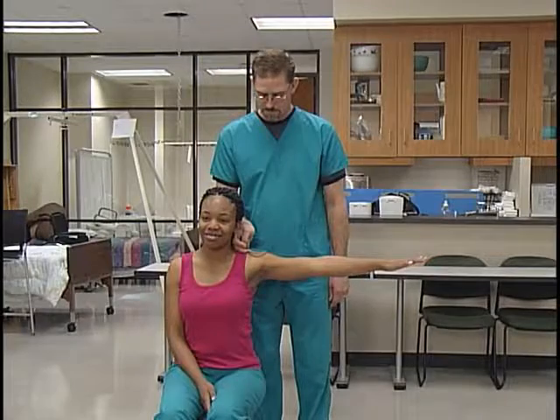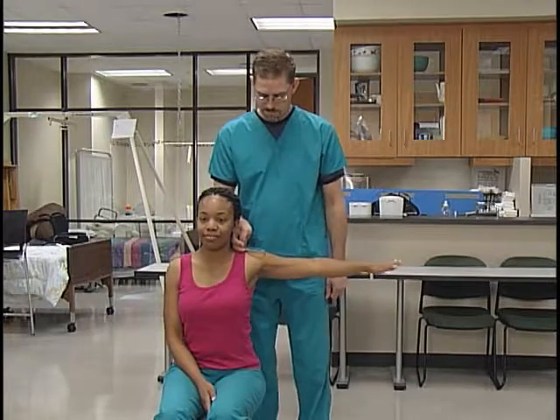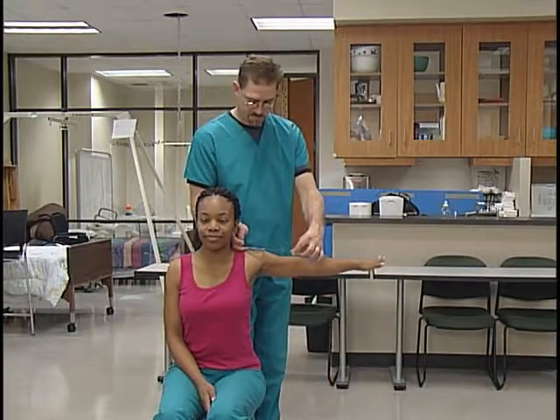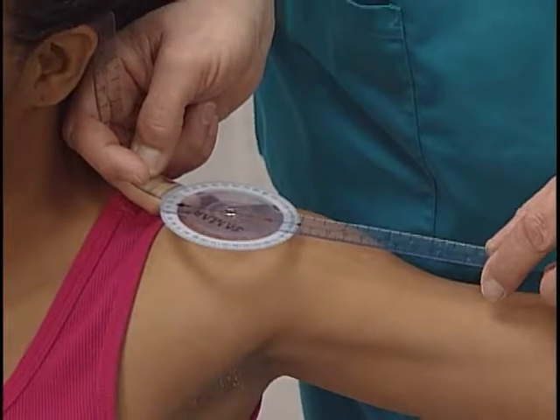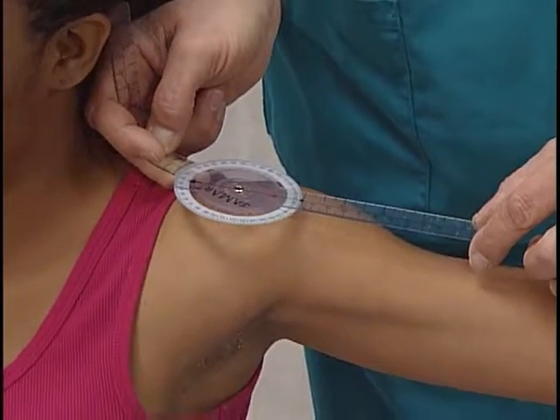The client's arm is moved toward the back of the body in the horizontal plane of movement. The measurement begins at zero degrees and ranges to 40 degrees.